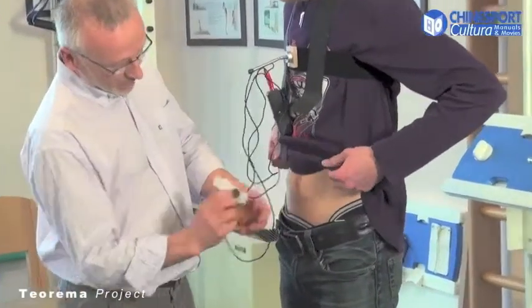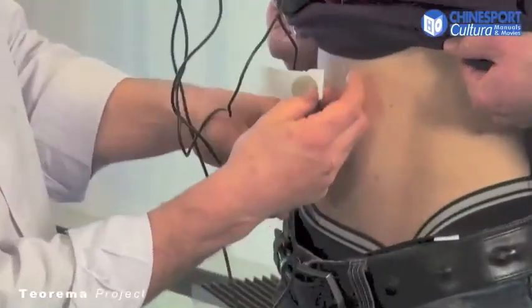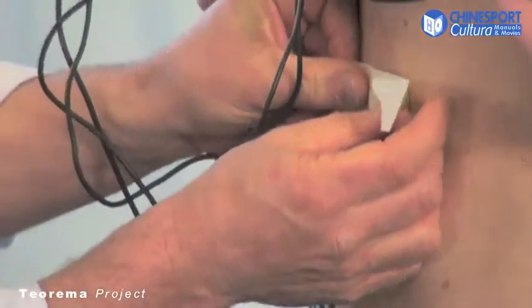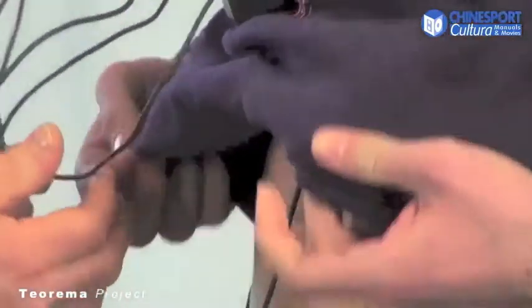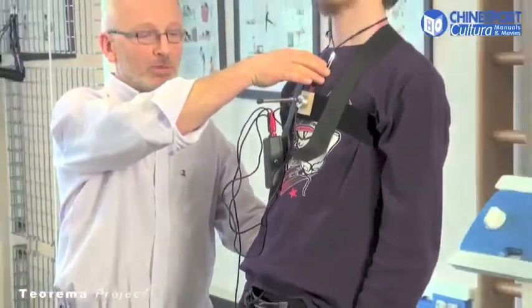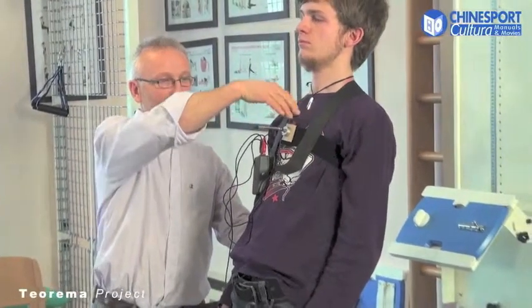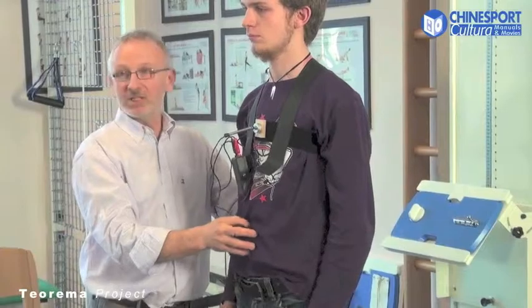We proceed to position our vibrating pad using a bit of scotch tape, at the point deemed most suitable. We ask the patient to do the task and, as soon as the patient exceeds the range set beforehand, this vibration is activated, warning the patient to maintain a correct position.